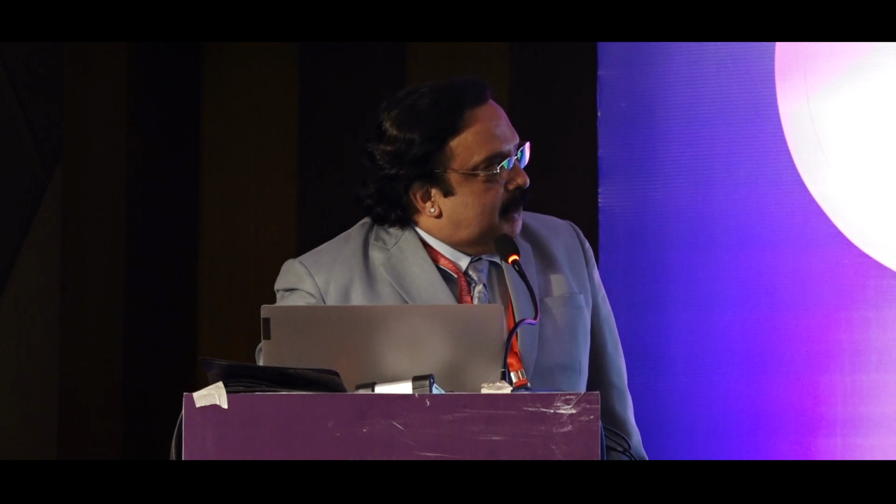This is an example of filling with cement. This patient has a loosening of the implant, so the implant was removed. The medial side was having a contained kind of defect. So cement was filled in and a screw was put in to hold the cement. And this is the final result.